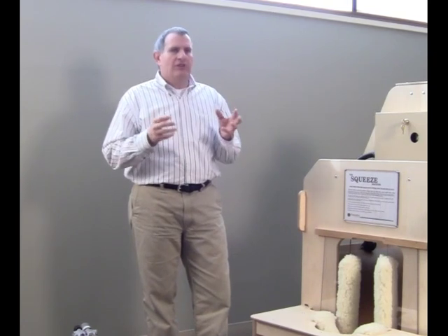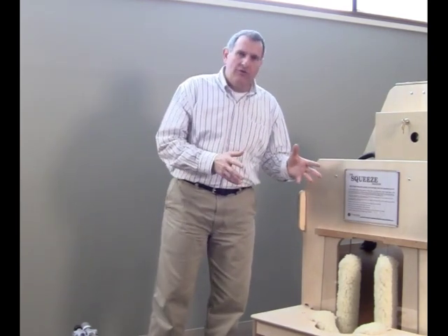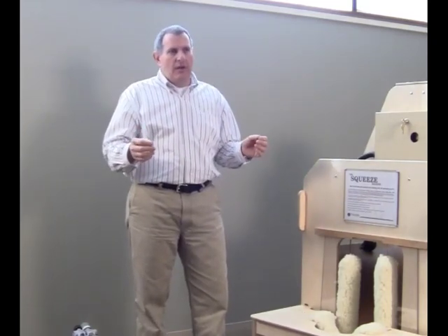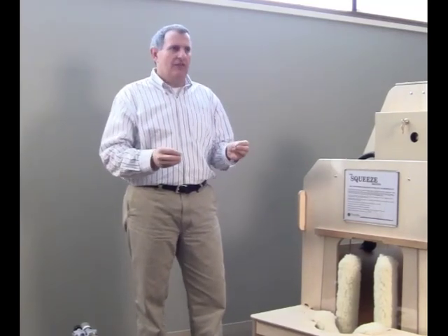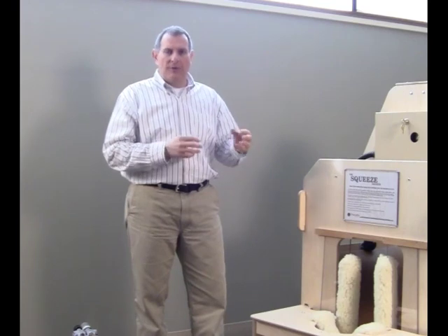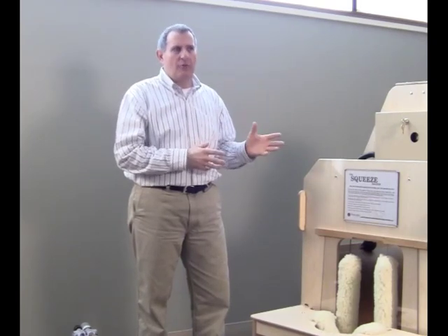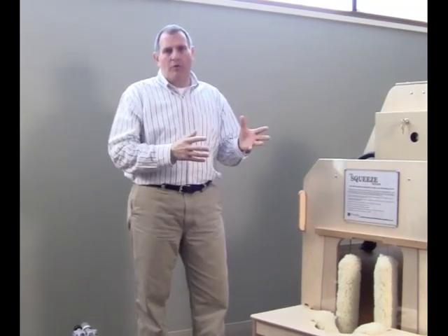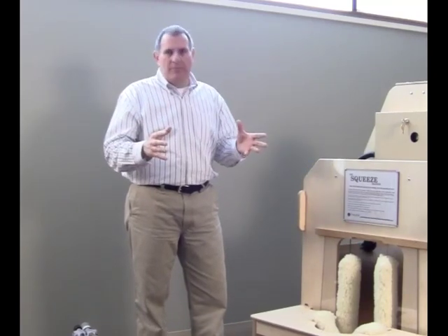So I want to encourage you to look at their actual characteristics. It really is most effective with smaller children, going up to the pre-adolescent years. One pattern we've seen is that during the adolescent years, when they're going through hormone changes, it's very challenging to get them to accept the squeeze machine. Sometimes it's a last-ditch effort, but we don't suggest using the squeeze machine as a last-ditch effort to help calm an individual. It's much better to start early and have a program where they can learn and grow, and that pressure can help them and calm them down.